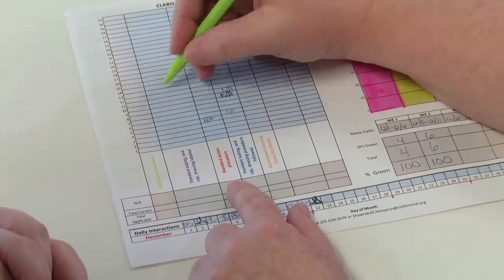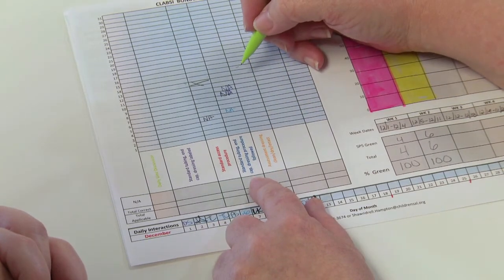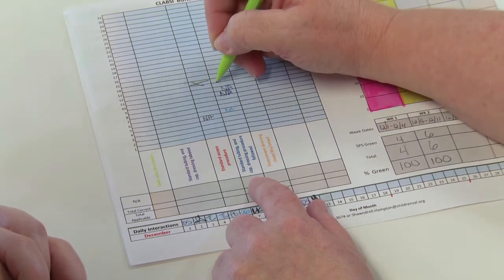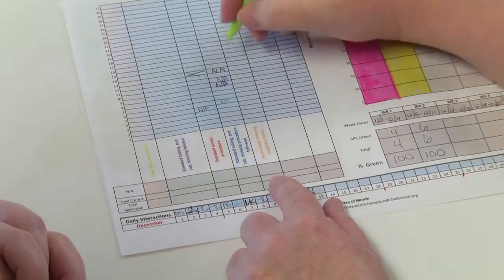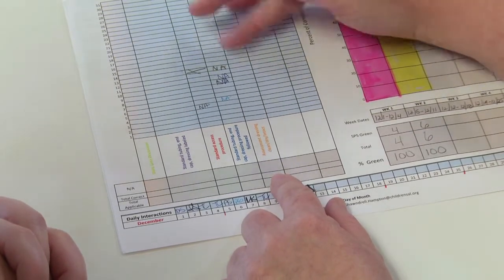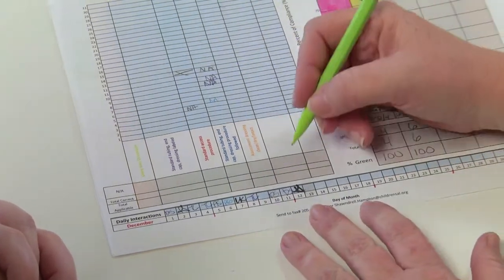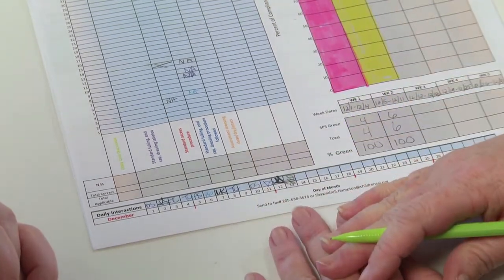So I'm going to put an X on today's date. Okay. There was no tubing, so therefore I'm going to put an NA because I couldn't look at labeling. Okay. And we did assess that the dressing was indeed clean, dry, and intact. Okay. So I will leave that blank. And lastly, I'm going to go to today's date and initial so that they know who did the interaction should they come back and review it.